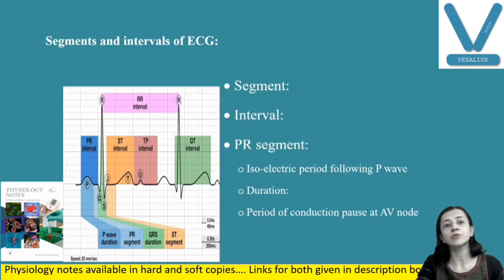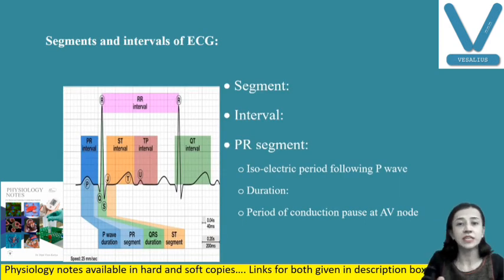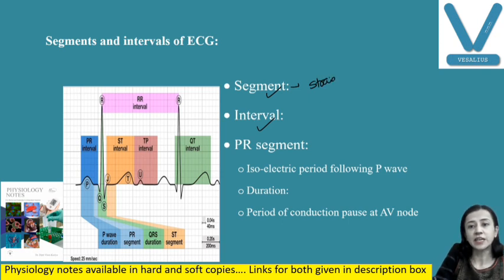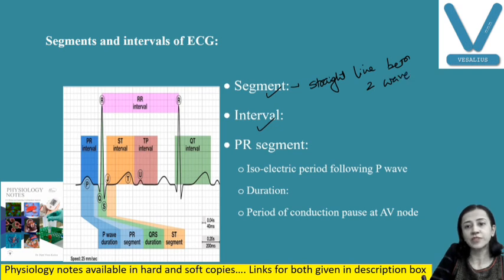Now we will discuss segments and intervals. A very important thing here is, what is the difference between a segment and an interval? A segment is a straight line connecting two waves, a straight line between two waves, or you can say an isoelectric line between two waves, with no wave included. An interval is one wave plus the connecting straight line.